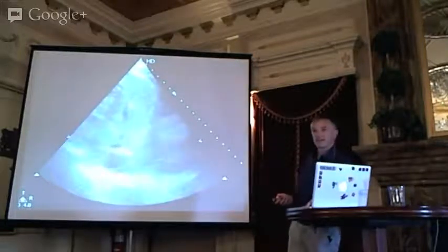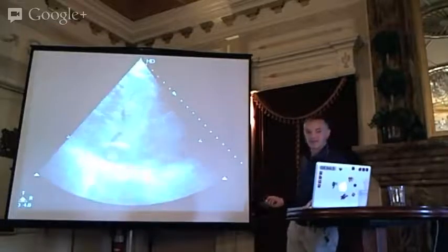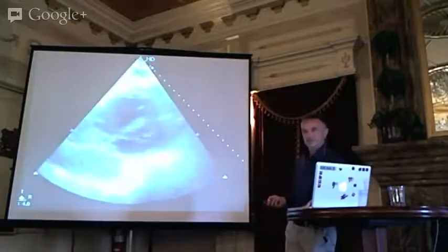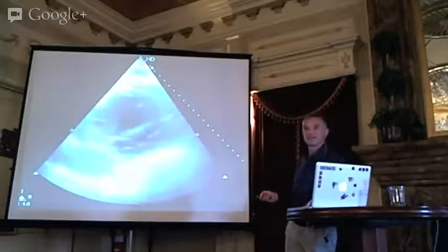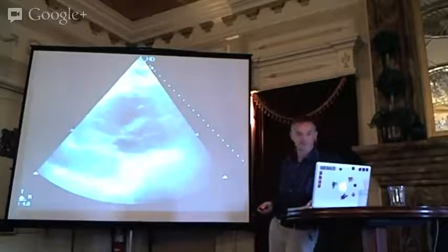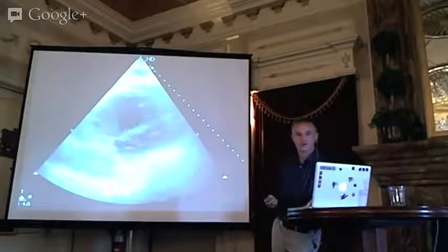If you're lucky, you might get a patient like this. He's got a bit of thrombus floating around the heart. Or this elderly shock man. He's got thrombus in the right side of the heart, sticking through the tricuspid valve. But you don't know what's even causing it. You know, signs of acute right heart strain.